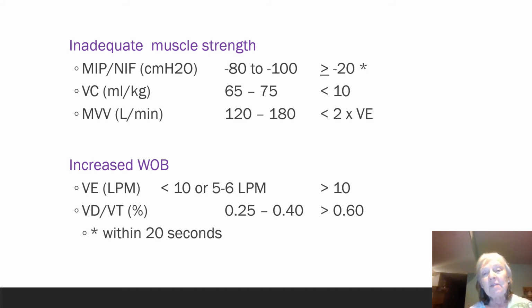Most times, if you have a patient who's been breathing 30, 32 times a minute, and now they're beginning to slow their breathing down because they're starting to tire out, if you ask them to go ahead and do an MVV, you're probably going to see them coding on you. So if you're going to have to do this, you need to make sure that your physician is with you.